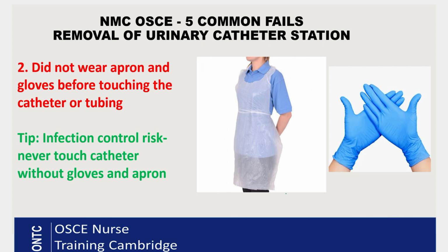So make sure you talk to the patient, take your consent, tell them the post catheter symptoms and all that, and then go and get your equipment, put your gloves and apron on, then expose the patient, and then you can deflate the balloon and all that. So do not touch any catheter or tubing in a hurry to see, oh, let me see where the catheter is, where the balloon port is. Don't do that until you have gloves and apron on. So that's really, really important.